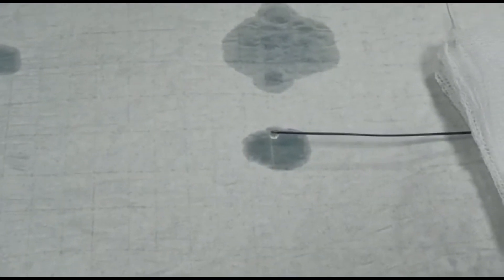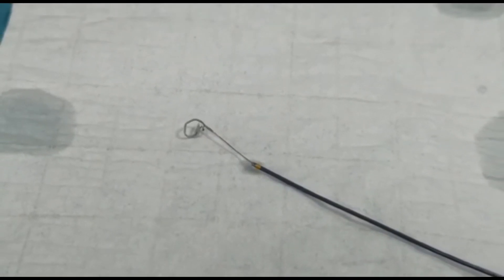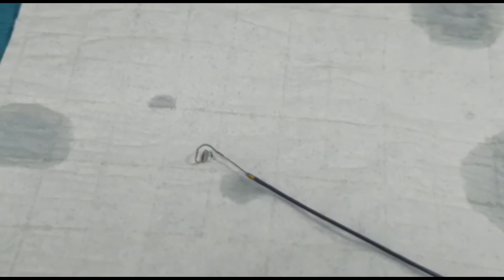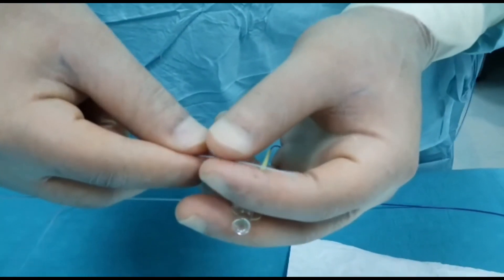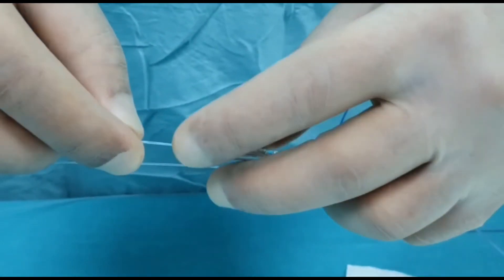You can see the coil will come out soon — here it comes. As I push it, you can see the coil. It has not yet been deployed. The beauty of this system is that if I'm not happy with the position, I can pull it back — all the way back into the hypotube sheath. I reposition my micro catheter to the place I like, then push it back again.